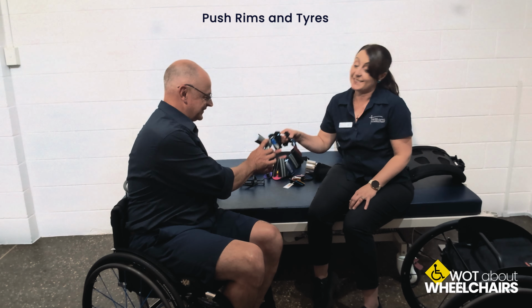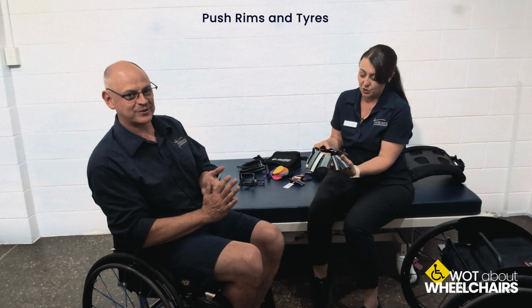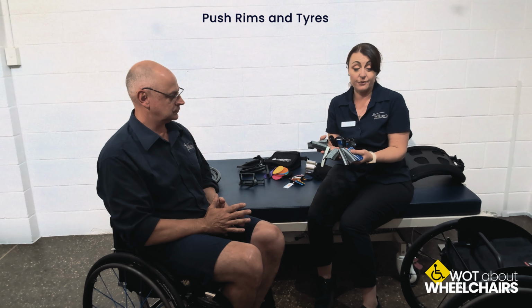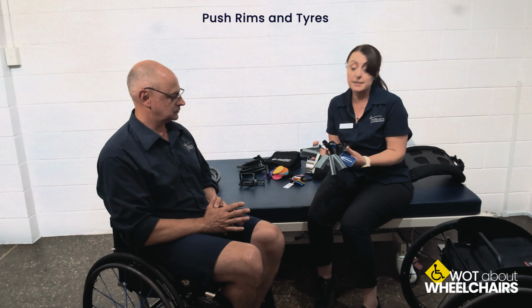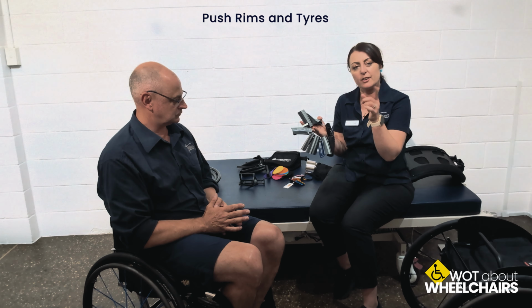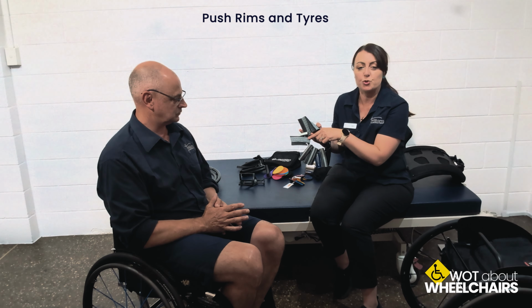But we have more choice. We have lots and lots of choice. So this is just a few examples of some of the different types of tyres that are available for different wheelchairs. I don't know how much you can see here, but there are different treads available.